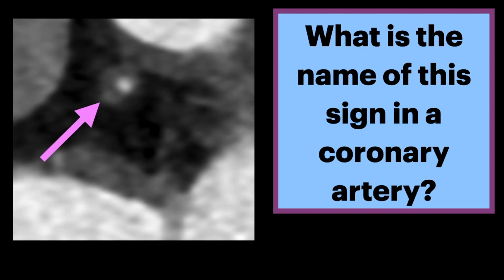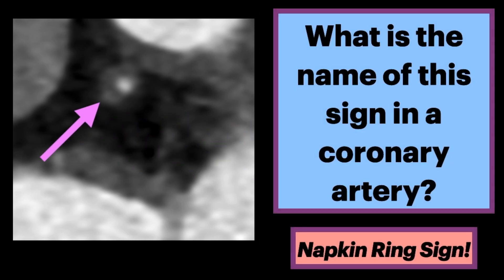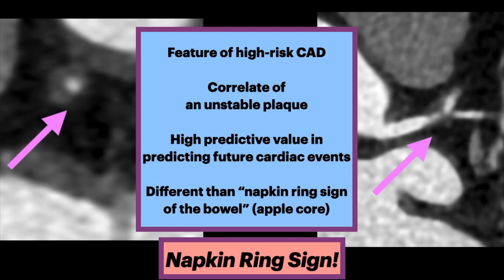What is the name of this sign in a coronary artery? This coronary CT angiogram shows the distal left main coronary artery with greater than 70% stenosis and circumferential atherosclerotic plaque. The answer is a napkin ring sign. This is a feature of high-risk coronary artery disease.